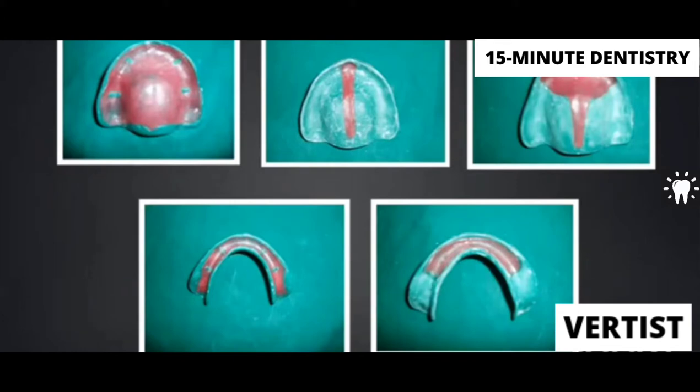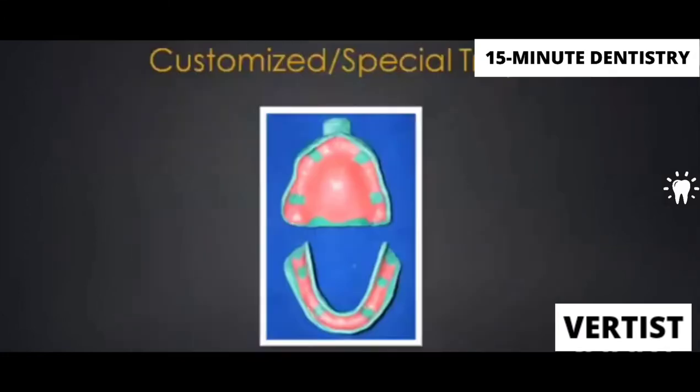That is okay. You should just be able to ensure that you know which impression technique you are following and how is your spacer design and the custom tray design, ensuring that you are delivering selective pressure technique. Okay, so these are the final customized trays. This is how they should be ready.